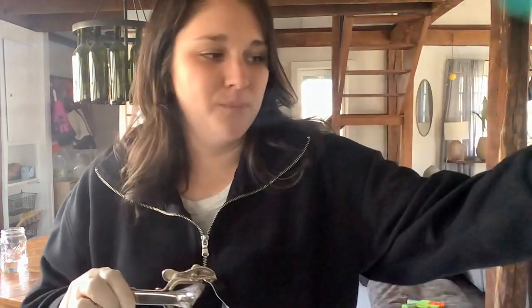Next, I'm going to do the speculum exam. Olivia, have you ever had this done before? And any concerns that you have with me doing this exam? Hopefully that will be no.